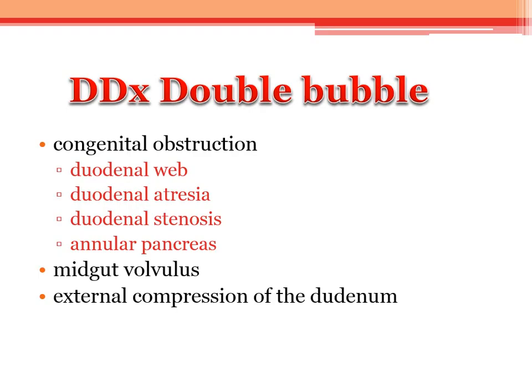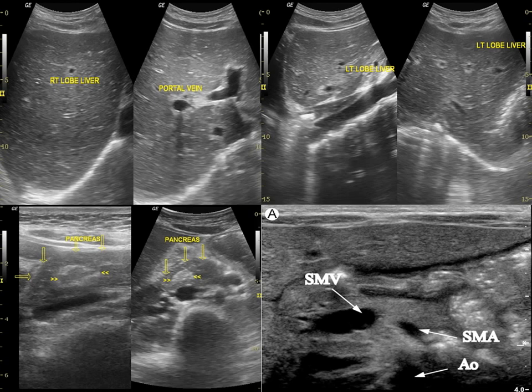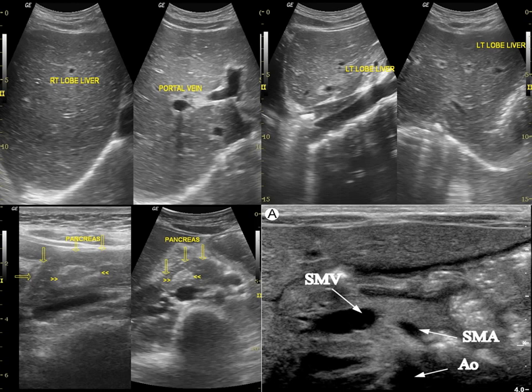So what comes to mind with the double bubble? First is duodenal atresia, but is it duodenal atresia in all cases? No — we also have duodenal web, stenosis, and volvulus. We should further evaluate. We did something less invasive, safe, and available: ultrasound. The ultrasound shows the right lobe, left lobe, portal vein. If there's a double bubble, we suspect malrotation, so we look at the SMV and SMA relationship.